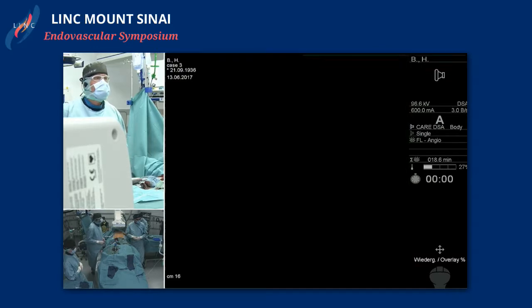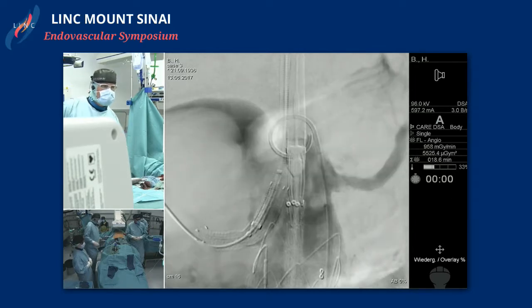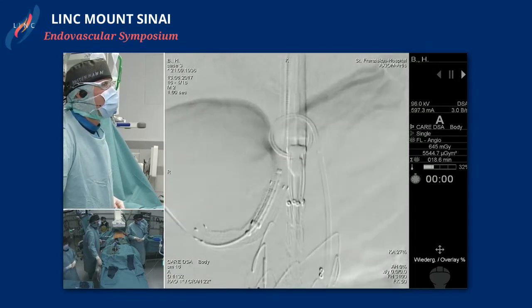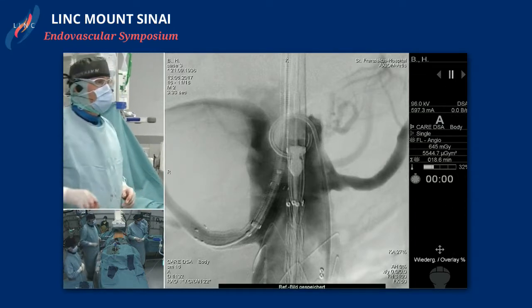People kind of discuss the eye of the tiger, where you'll come in and dilate up a balloon expandable stent and then put a smaller balloon in, and then when you use your cuff, you kind of make a round stent into more of an oval. Has anyone tried that? No. Okay.